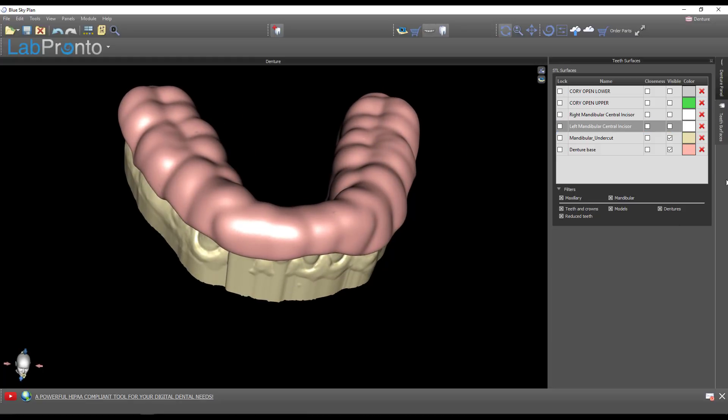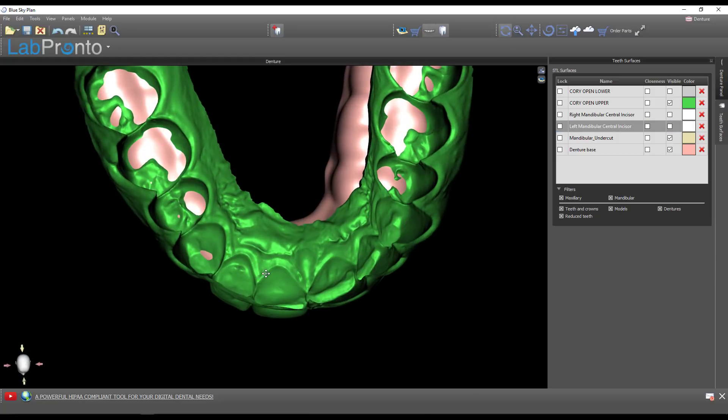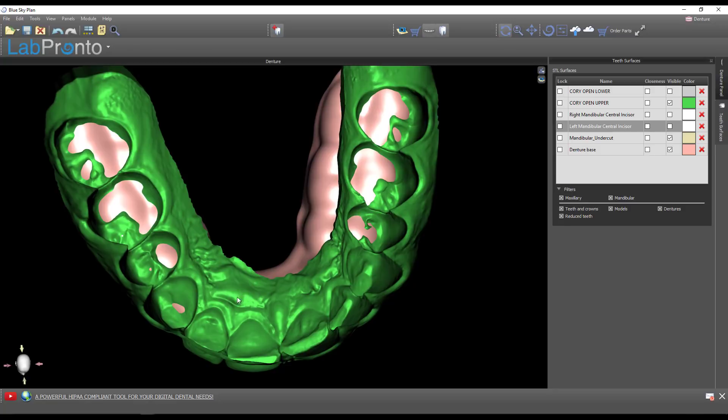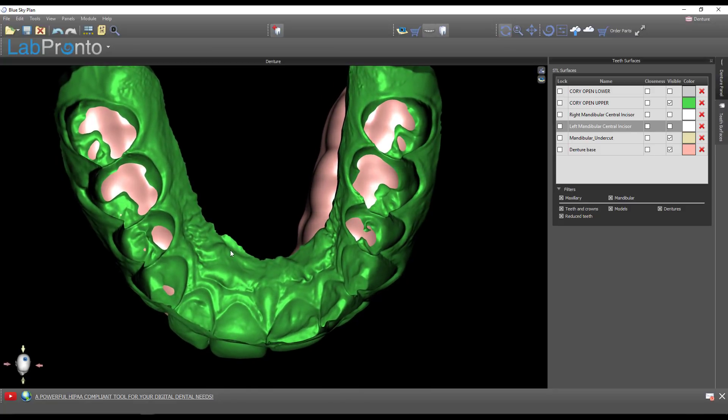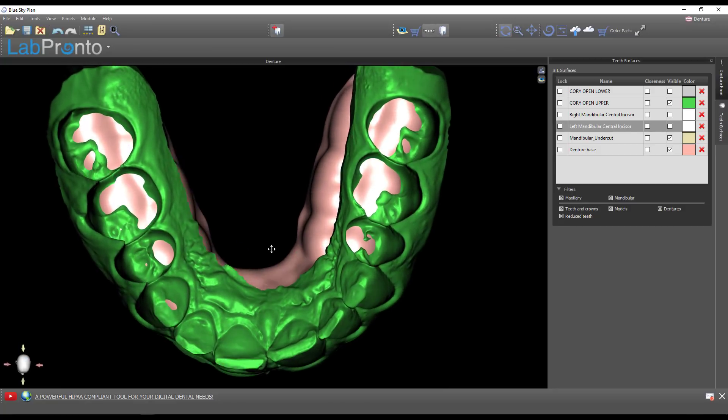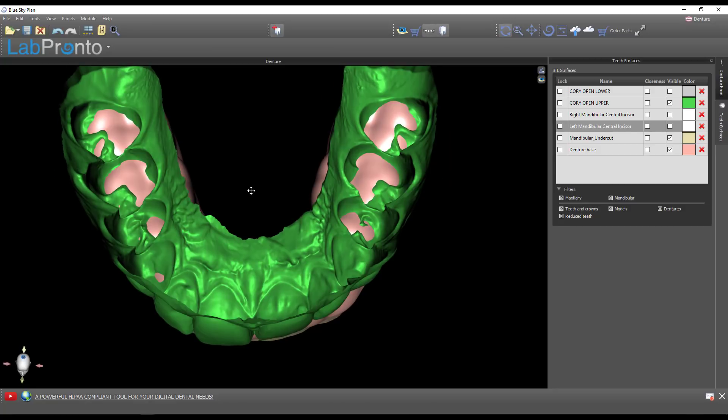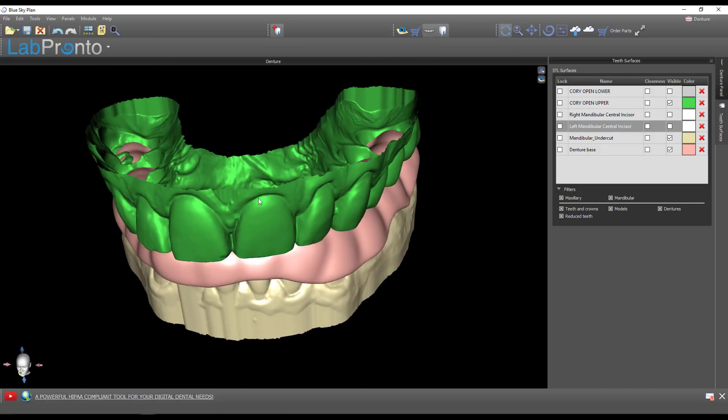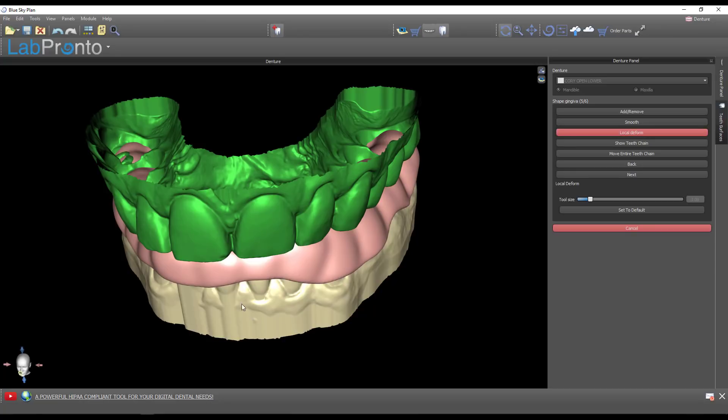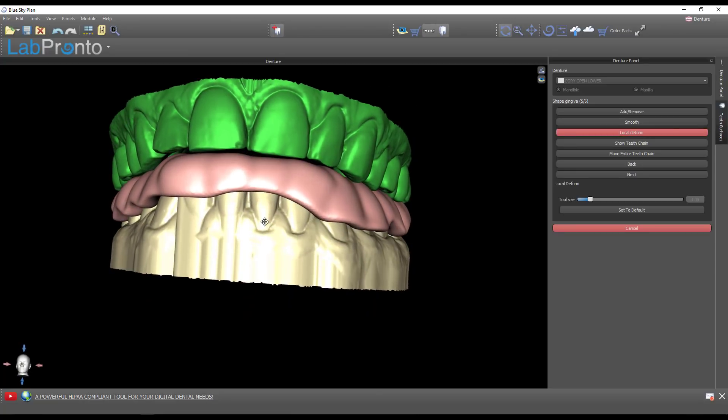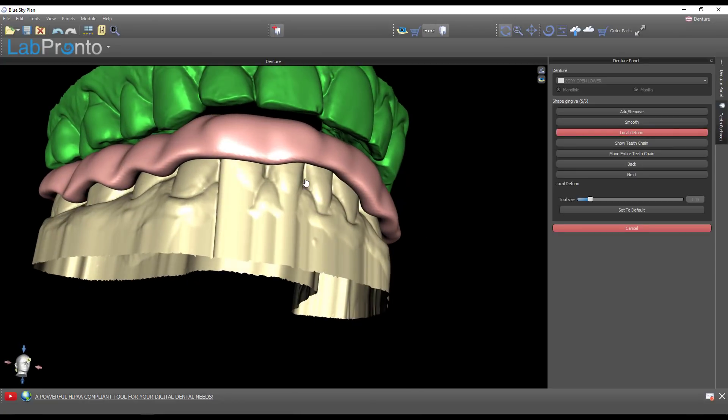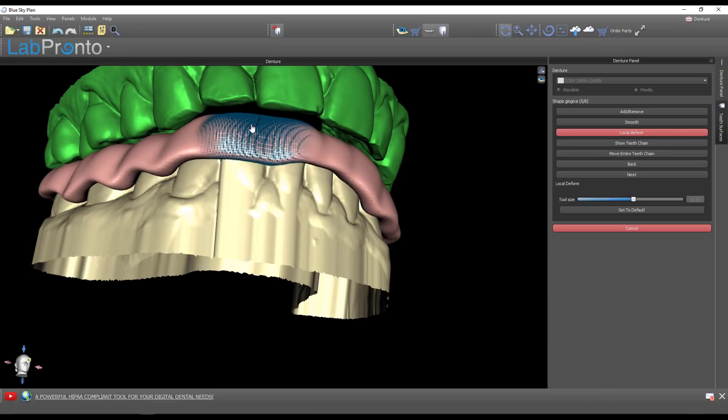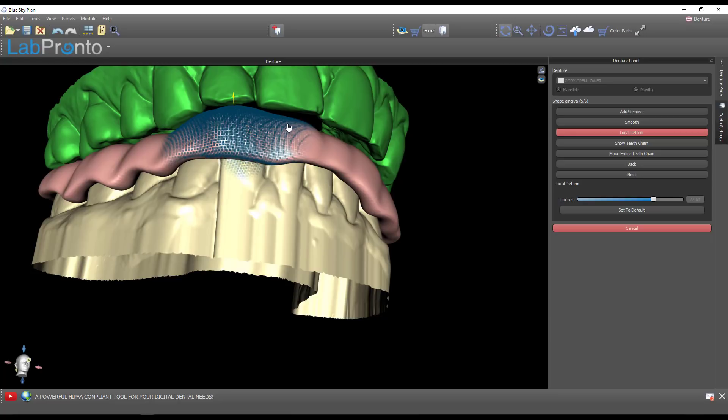At this point I don't need those teeth on anymore - I was just having those present to allow me to build this denture base. Now we can start the shaping process. This is why I told you to use an open model - because now that this is open, I can look through the top of this maxillary model and begin using this to adjust my occlusion. I can use the local deform tool and drag that up.